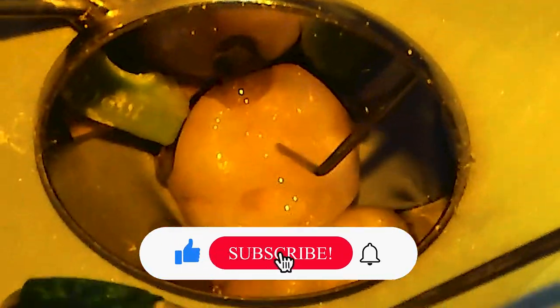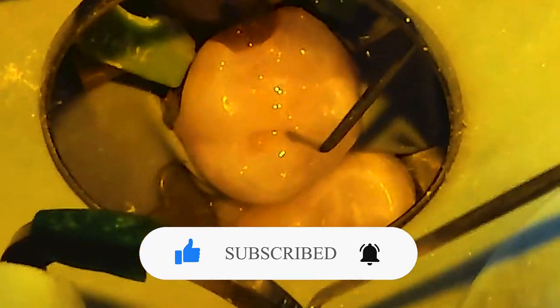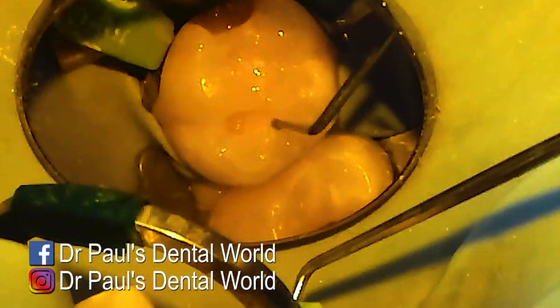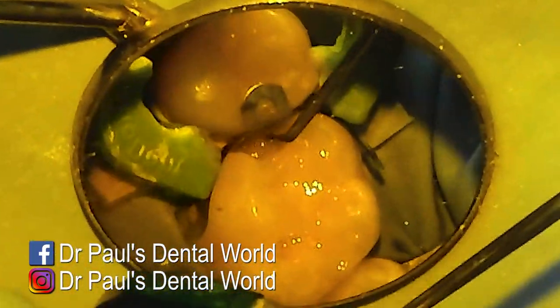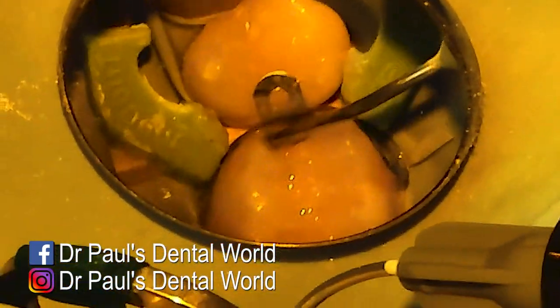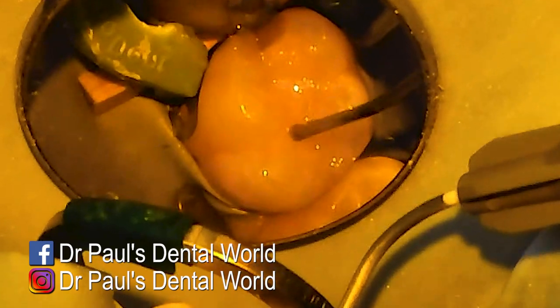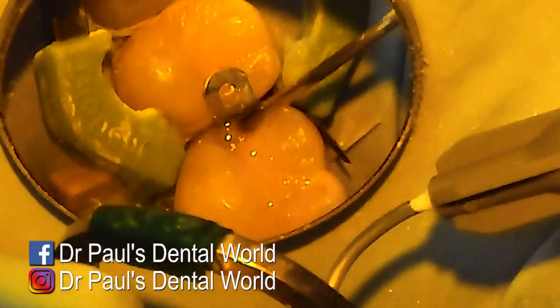Trying to make sure it's not touching too many walls of the actual cavity at once, then we'll agitate and adapt it to the walls with the explorer. I'll do this on the box portion of the Class 2 cavity on the front part of the tooth as well — this is the most important part to make sure it is well adapted. Then again we'll cure it and just keep going through these increments.